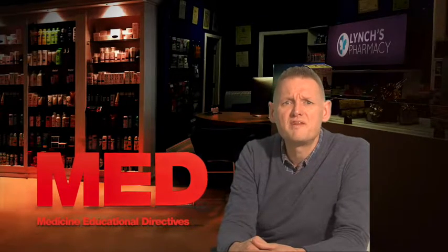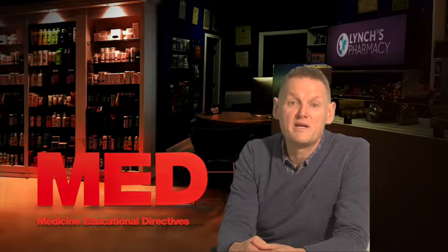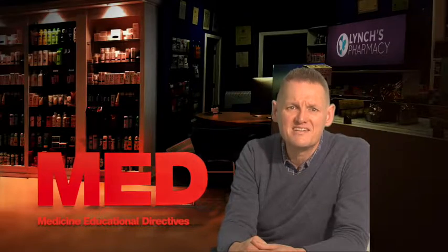So how do I store Apidra? The pre-filled pens, unused penfill pens should be stored in a refrigerator at 2 to 8 degrees Celsius. Do not freeze. Keep the pen in the outer carton to protect from light. Once in use, the pens should be kept out of the fridge below 25 degrees. They can be used for up to 28 days. The pen cap must be put back on the pen after each injection in order to protect from light. The pens should not be stored with the needle attached and should not be kept in the fridge once in use.